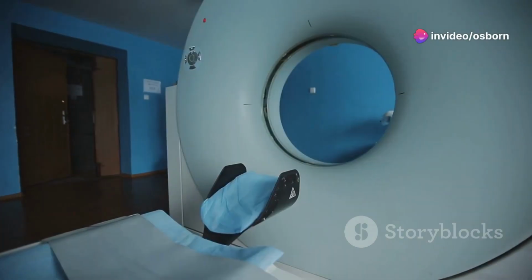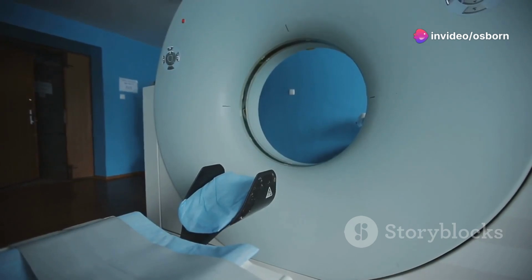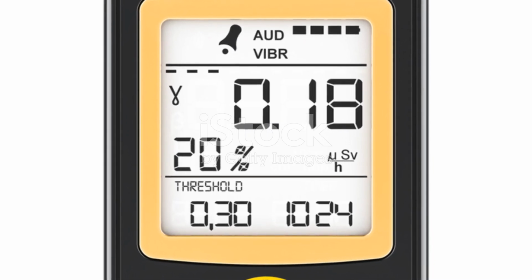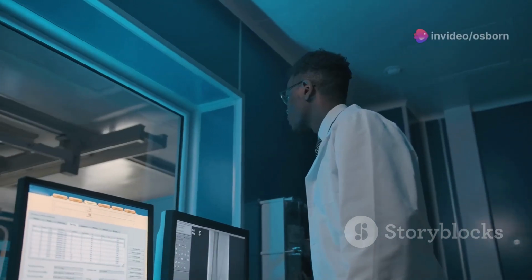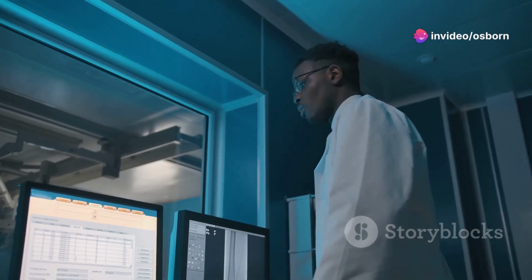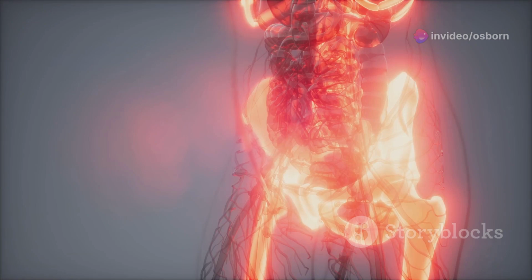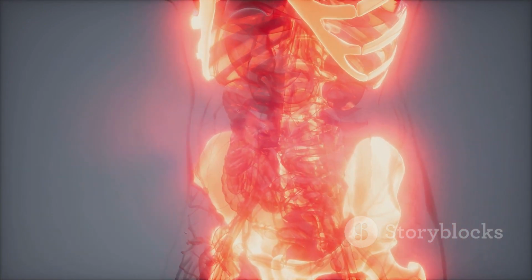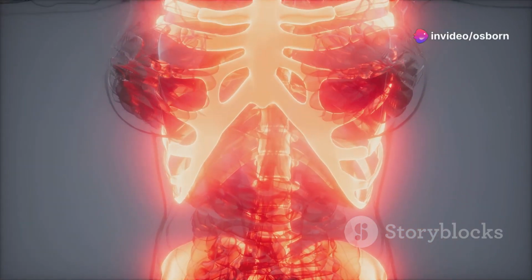As a beam of photons enters a medium like water or soft tissue, which simulates the human body, complex interactions occur. Initially, the dose increases with depth, reaching a maximum at Dmax. This build-up region is attributed to the production of secondary electrons, which deposit their energy further downstream. Beyond Dmax, the dose decreases exponentially with depth, primarily due to the attenuation of the photon beam through interactions like photoelectric absorption and Compton scattering.